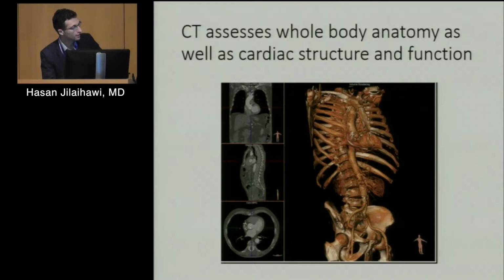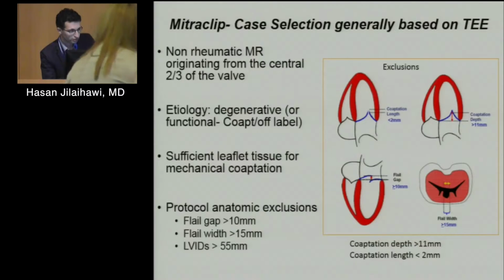The other thing to bear in mind, CT can assess the whole body anatomy as well as cardiac structure and function. I'll finish with this new concept of using CT in assessing mitral valve function.